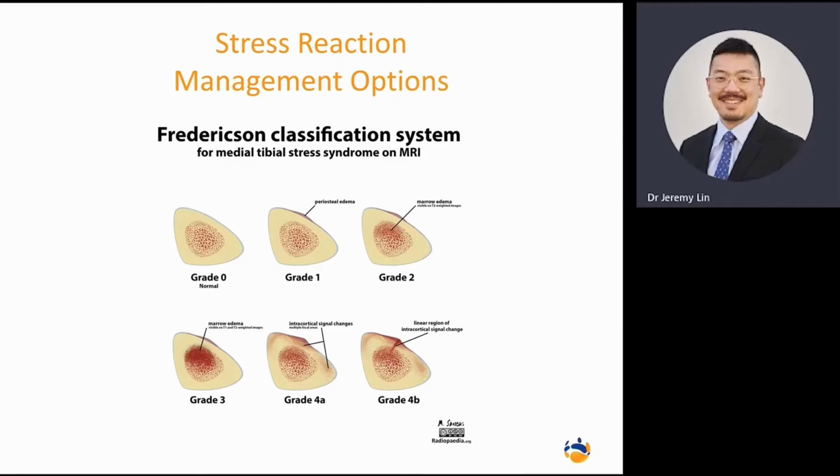Breaking it down to simple terms. Now, because of the way it's loaded, sometimes it may be useful to refer the patient on to an allied health professional, such as a physiotherapist, or to one of our sports physician colleagues who are better at managing these things. But MRI is very useful at guiding management.